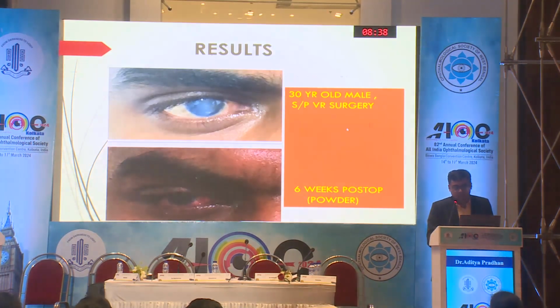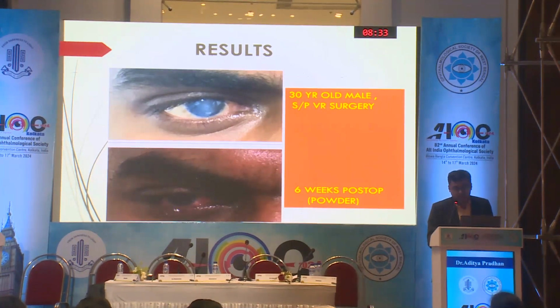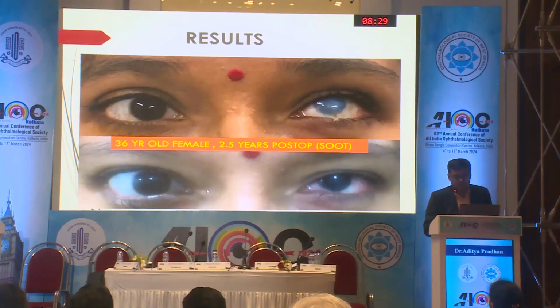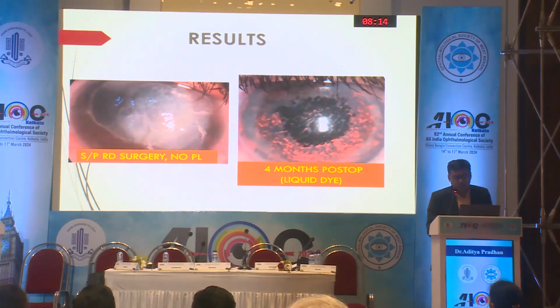This is a 30-year-old male who underwent VR surgery. This is the result 6 weeks post-op with the powder which was pushed into the lamellar pocket. This again is soot, which, as madam has shown, you can improvise in the OT by using a candle. This eye was highly disfigured, and for cosmetic reasons this was the outcome. Again, this was status post VR surgery, a non-seeing eye.